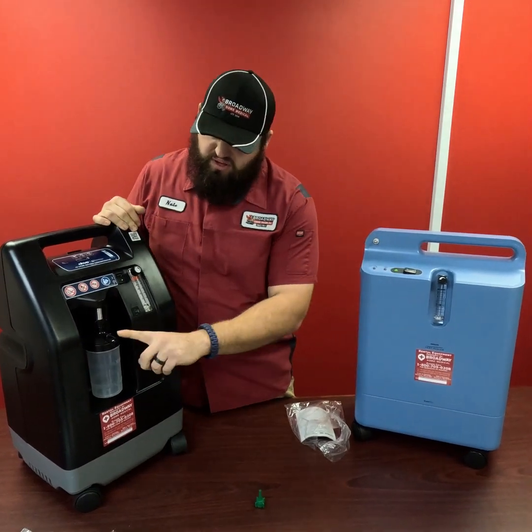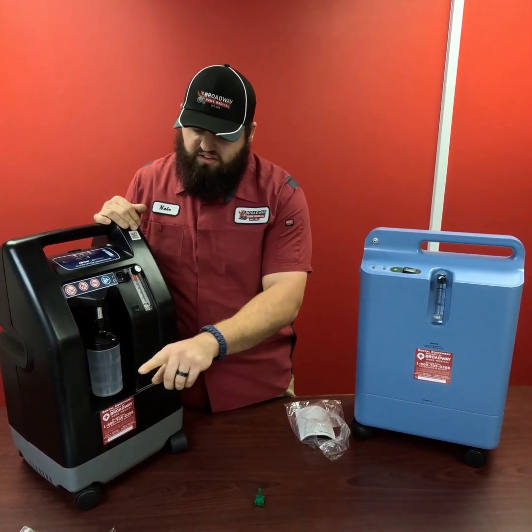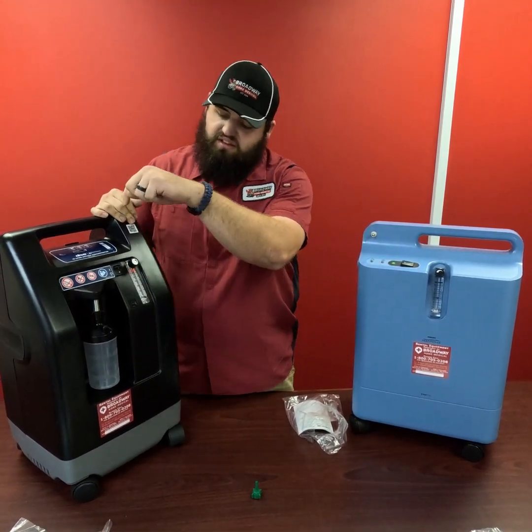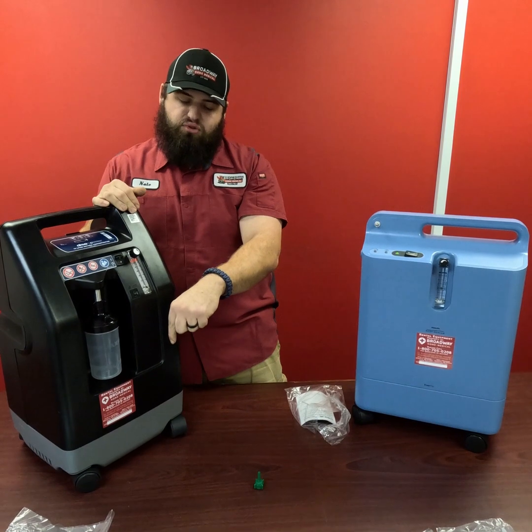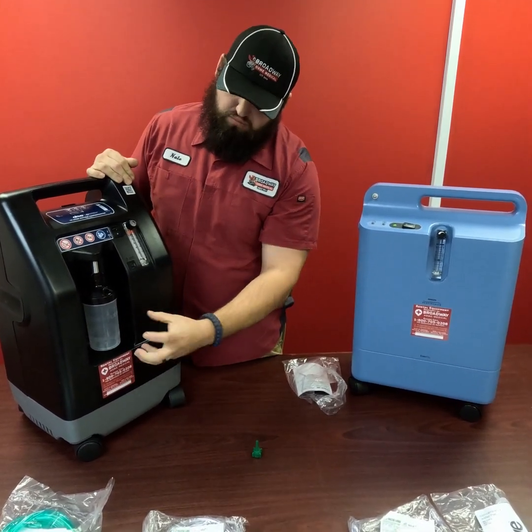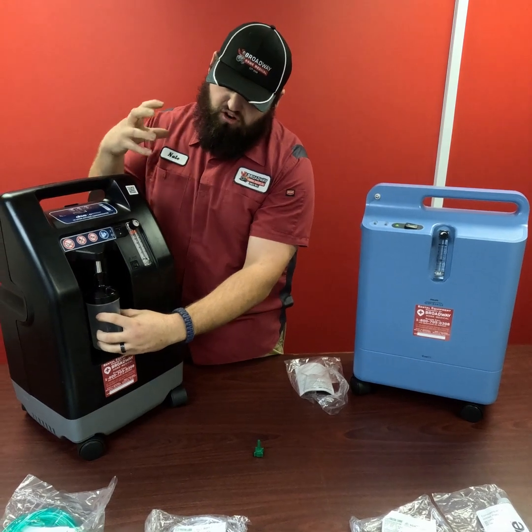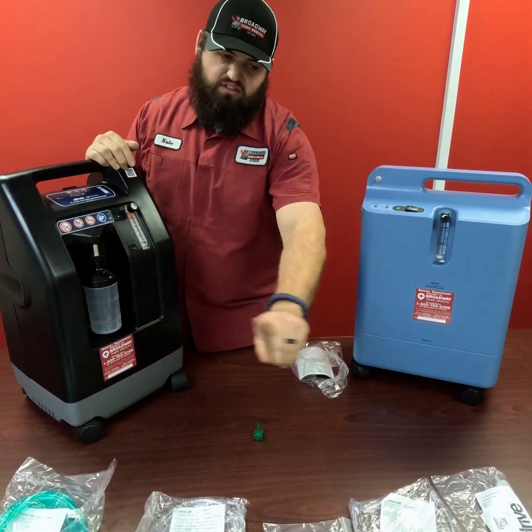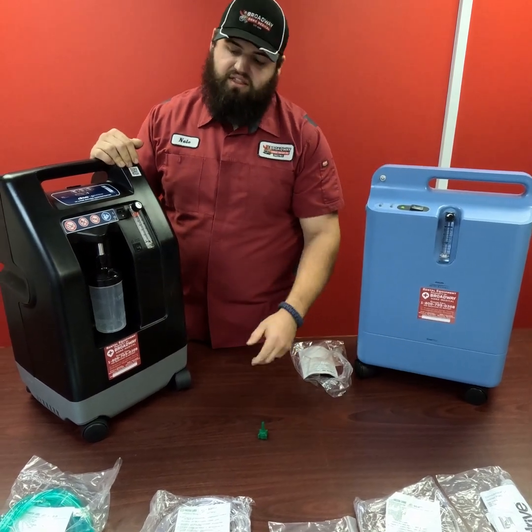So from there, we can actually attach hoses to the end of this little nipple here, and what that does is the machine will actually push oxygen down into the water, and from there the jar will actually create pressure, and it'll allow oxygen to come right through that lid.